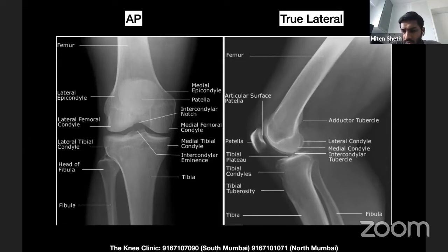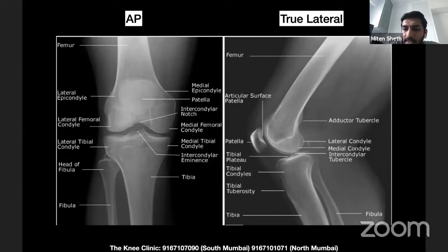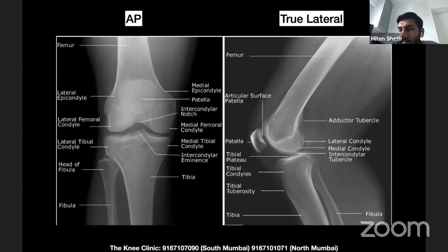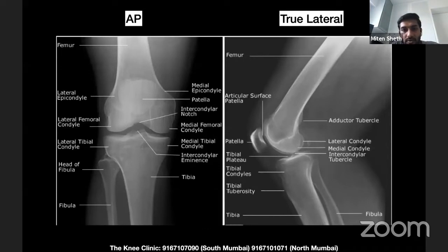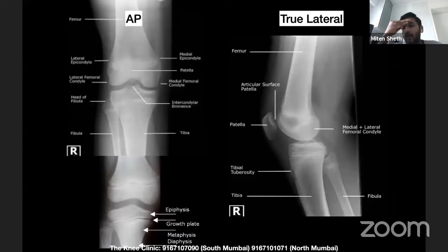Most lateral X-rays are preferably taken in around 20 to 30 degrees of flexion. In acute trauma with a very painful knee, a horizontal beam lateral in extension is also acceptable. In fact, for picking up hemarthrosis, horizontal projections of the lateral in extension are much better than the flexed knee position. The bony markings on these views are self-explanatory, assuming knowledge of the parts of the knee.